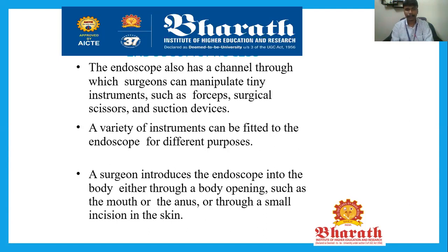A variety of instruments can be fitted to the endoscope for different purposes, according to the need and the purpose demanded for the patient. The surgery will vary accordingly. A surgeon introduces the endoscope into the body either through a body opening such as the mouth or anus, or through a small incision of the skin. Mostly it will be inserted through the mouth.